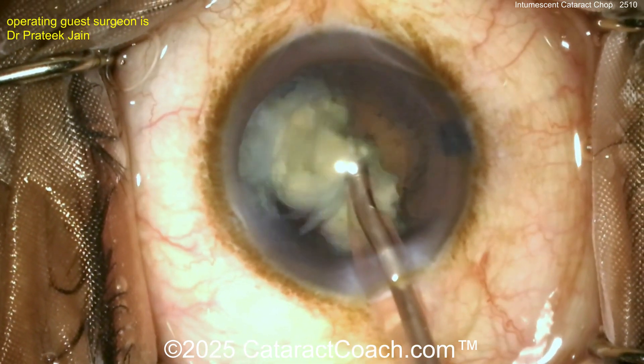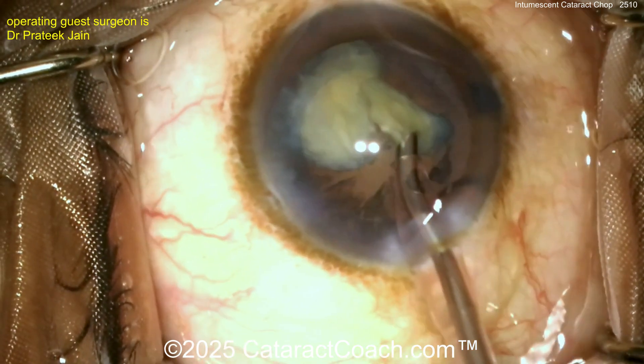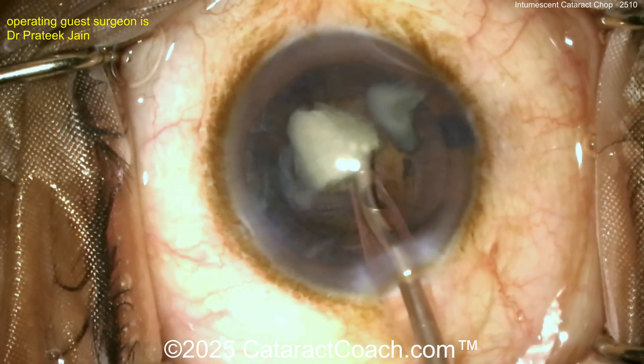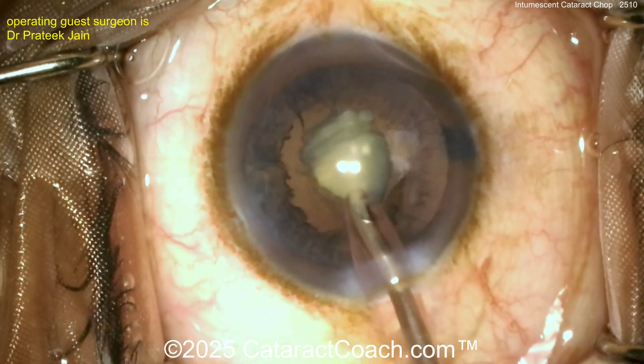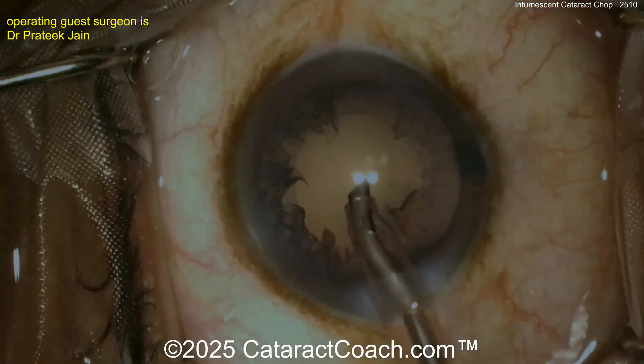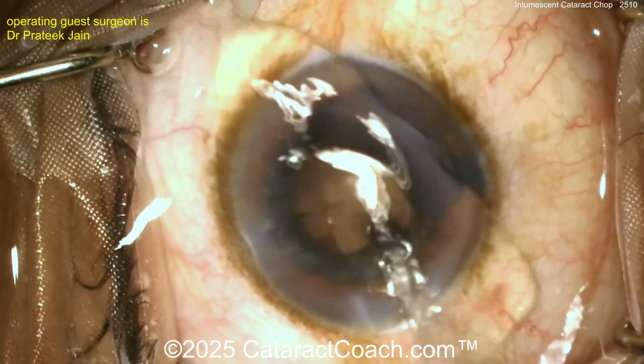Taking out this cataract piece here — honestly in a case like this I still want my other hand inside the eye, because if I have my other hand in the eye I can feed the pieces in, keep the posterior capsule at bay. But in this surgeon's hands — look at that one-handed removal, pop up, done. Beautiful.